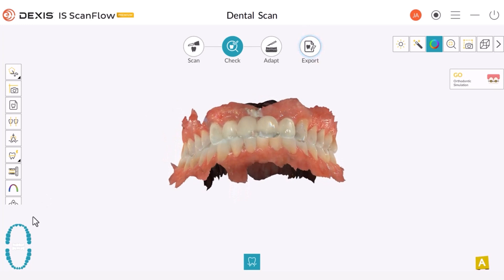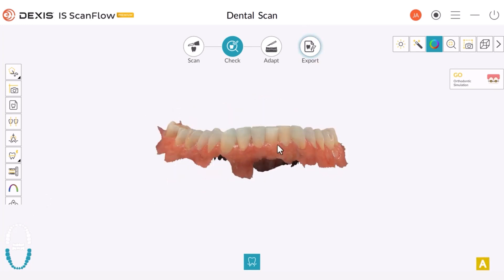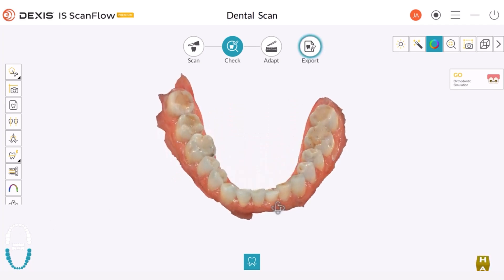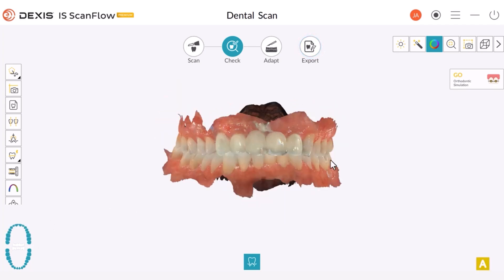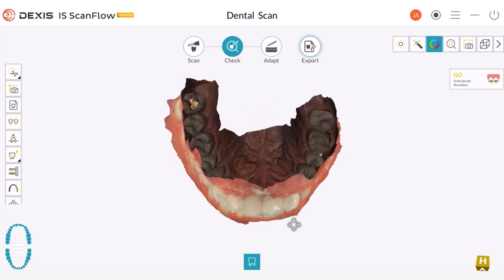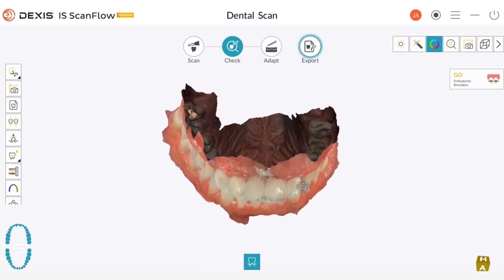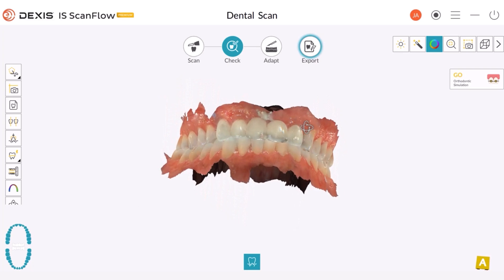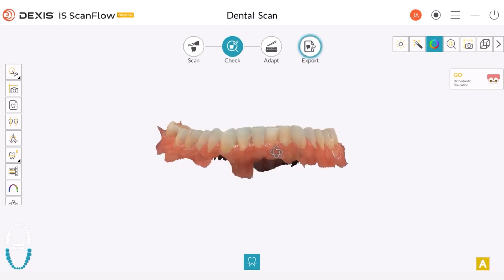By toggling these switches, we can seamlessly switch between viewing both the upper and lower arches or viewing one at a time. This toggle feature allows us to examine the arches with precision. For instance, if we wish to review only the lower arch, we simply deselect the upper arch and vice versa.